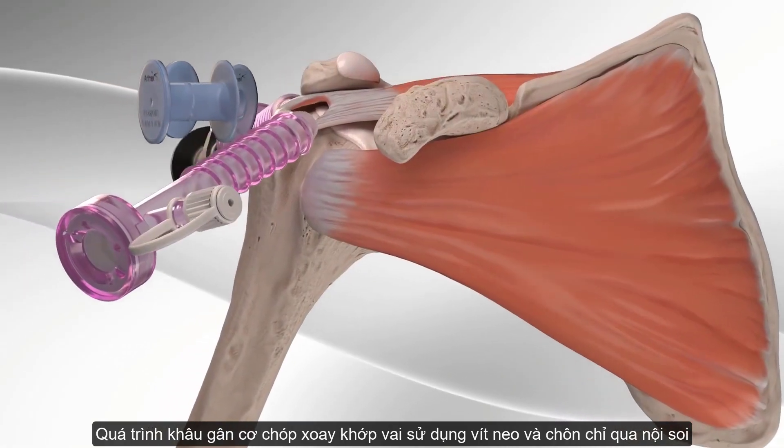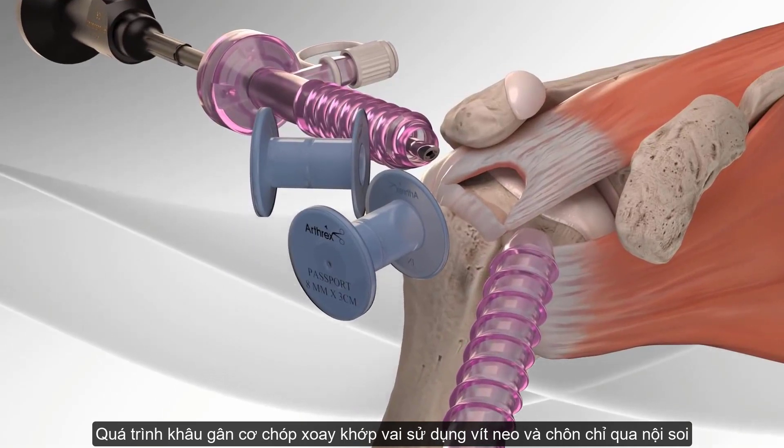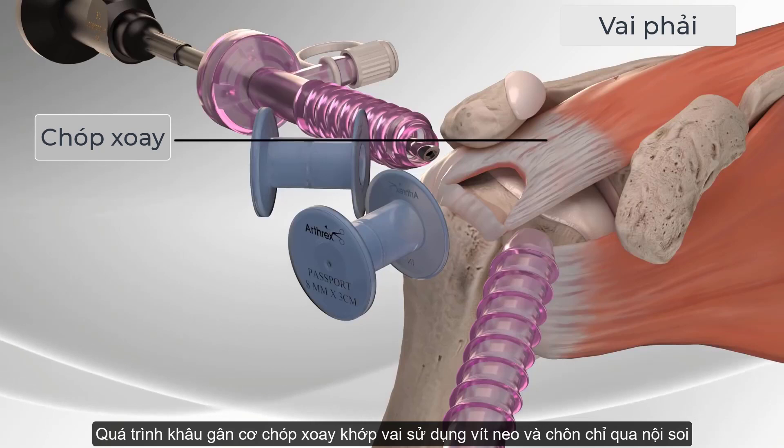The Arthrex Speed Bridge is a soft tissue fixation device that combines fully threaded swivel lock anchors with fiber tape. Your surgeon may use the Speed Bridge for repair of a rotator cuff tear.